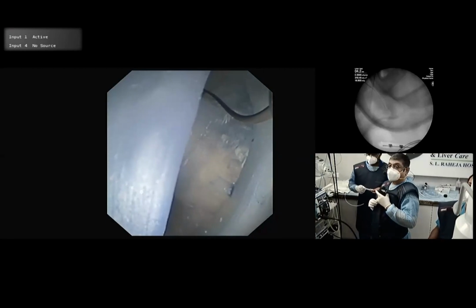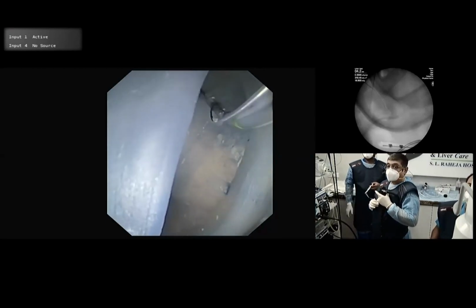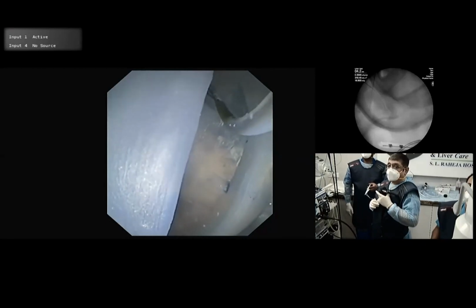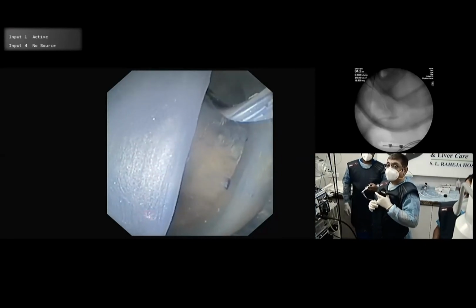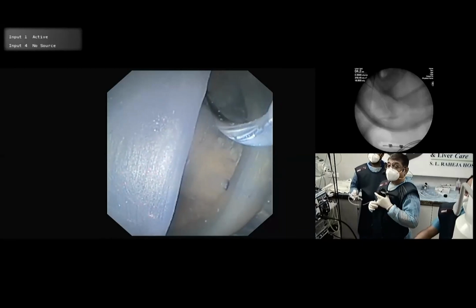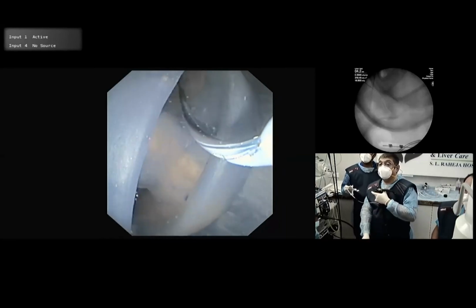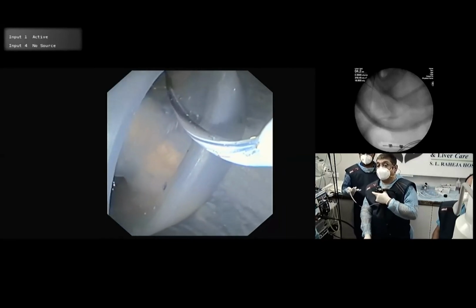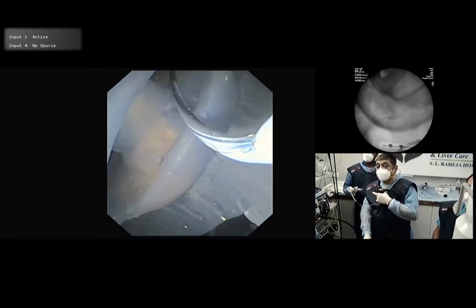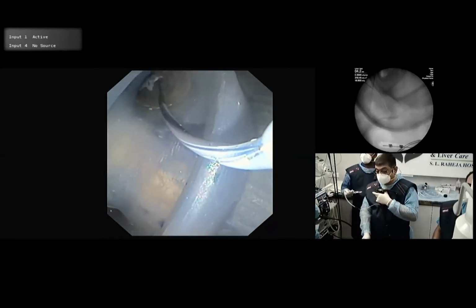So we are going in. I think some wire is also going in. Yeah, you see the sphincterotome? Now you are in the bile duct, and then you can complete your whatever treatment, stenting, stone removal. I find Rendezvous a good procedure in those rare cases of CBD stone where you cannot cannulate. This is of course very easy, but Rendezvous in benign cases is very, very useful. Like this, you can do a pancreatic rendezvous also. You can pass in the pancreatic duct. See, so this is a rendezvous procedure for you.